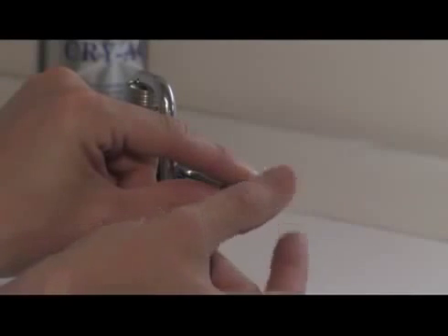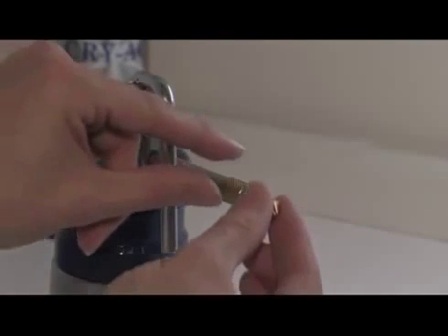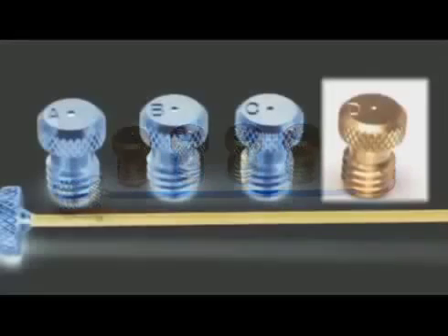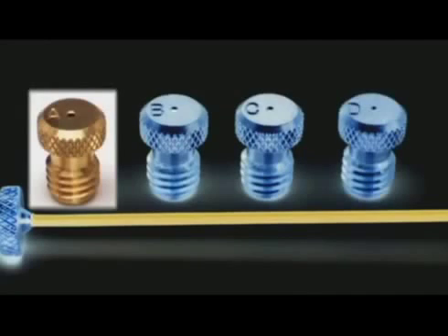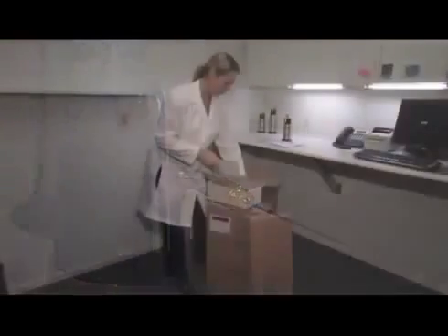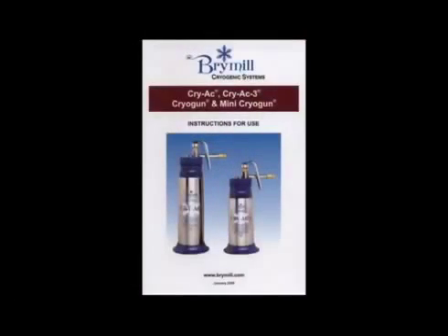The spray tips can be changed to determine the width of spray. The Cryac spray tip standard size is C — it's the most commonly used tip. You should have two C tips: one installed on the Cryac and the other in the Cryac tip package. The D tip is the smallest spray tip and the A tip is the largest. The bent spray tip was designed to get at hard-to-reach lesions. Also included is an instructional booklet, which should be read and kept in a safe place.